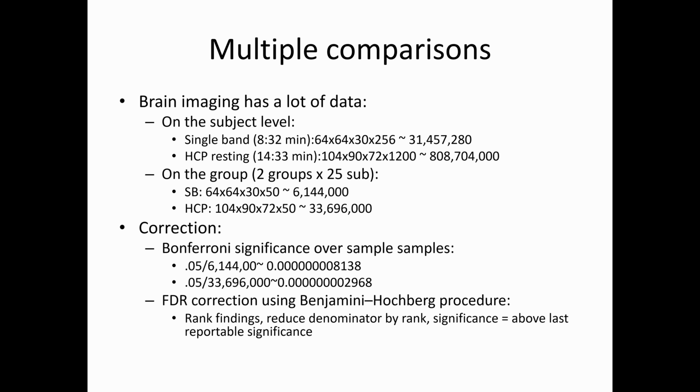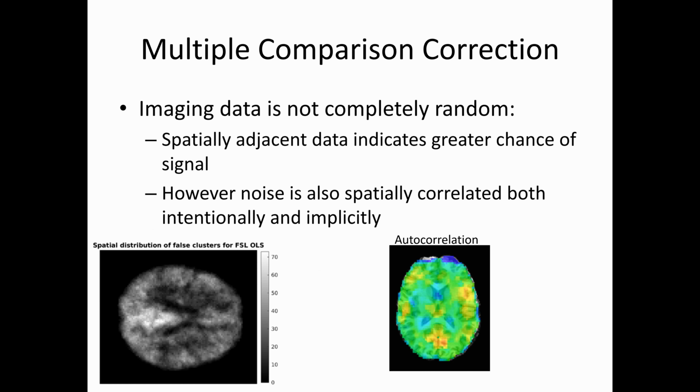So that's one way of, if you really do have a lot of significance in your data, it comes out. But you're still expecting some level of orthogonality of your data, which isn't the situation that we're at with the imaging data. So the imaging data isn't just completely random, it's not a random scattering of data. So spatially adjacent areas have similar signal.